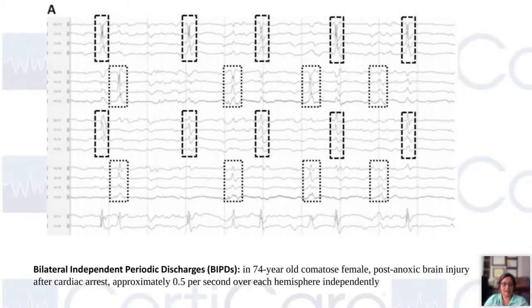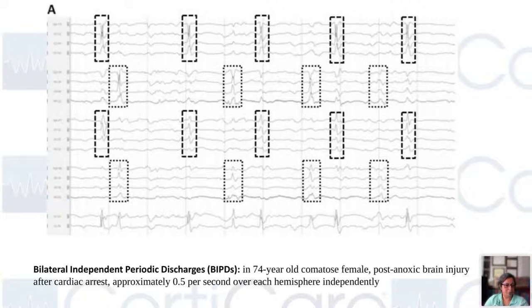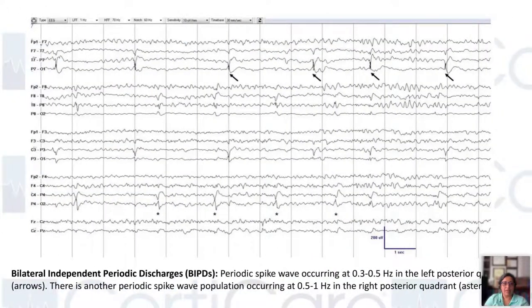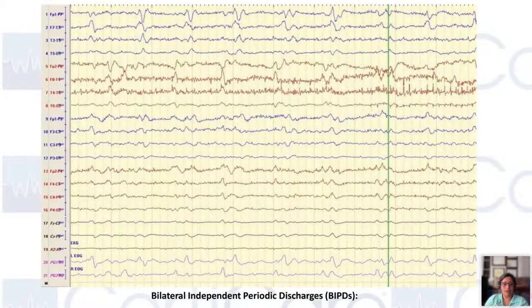Here on the EEG you can see left and right bilateral independent periodic discharges at 0.5 hertz, occurring asynchronously in both hemispheres. Another example shows arrows on the left and stars on the right side — they are of different frequencies. And here is another example of these independent discharges on the left and right side.